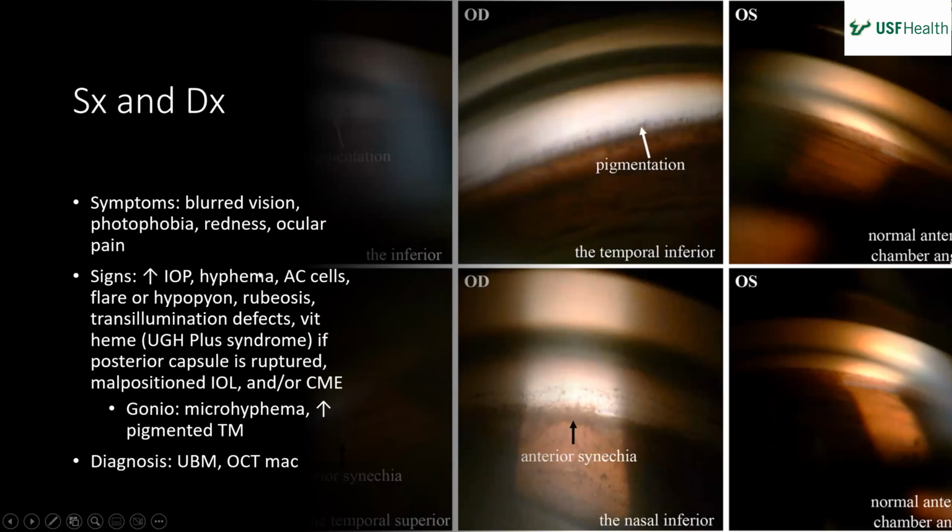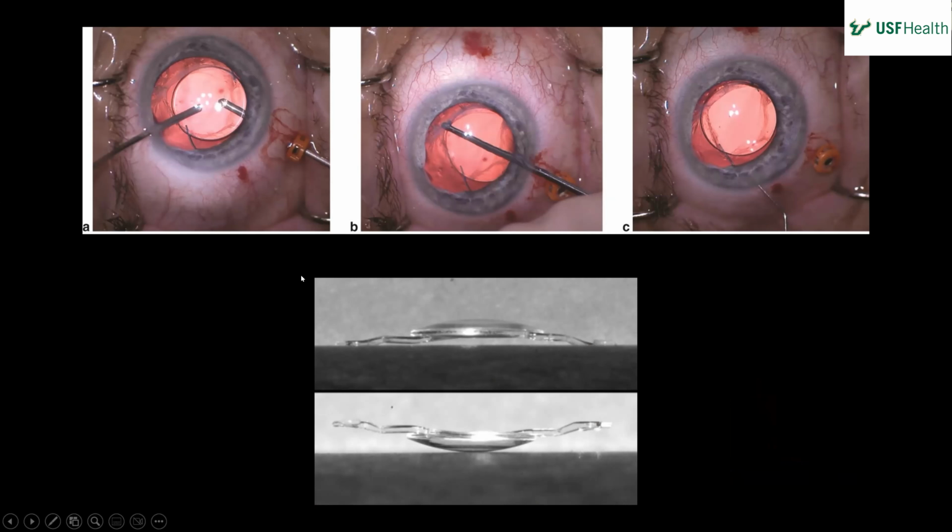If I could just chime in, in my experience upside down syndrome occurs with the best cataract surgeons because they're never putting in ACIOLs. So what happens is they get that one case in 5 years where they put an ACIOL in and they stick it in upside down just because they're all freaked out and they haven't put in an ACIOL. So just be careful about upside down. I've seen some really, really good surgeons do that, and it's a pain fixing it.